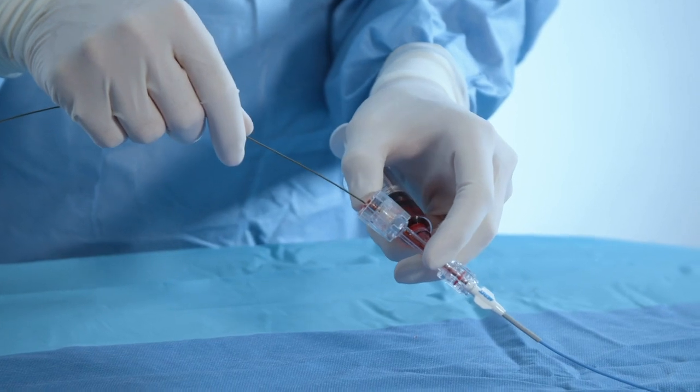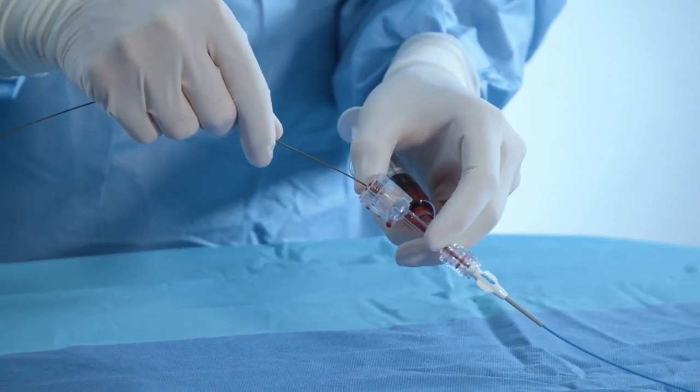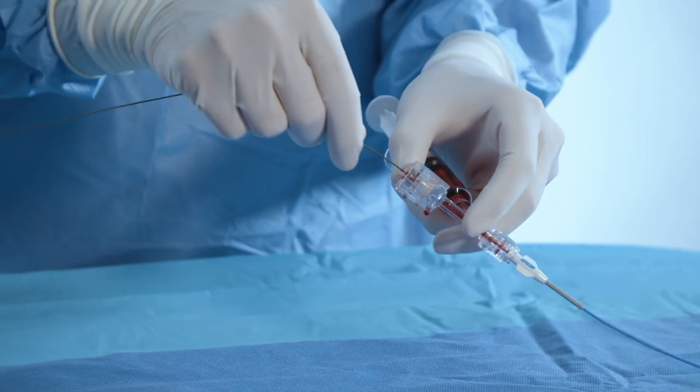The secondary push and release bleedback seal can be manipulated by pushing down on the top of the device, making it easy to manipulate the inserted equipment while maintaining hemostasis.